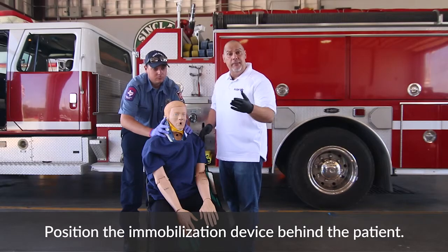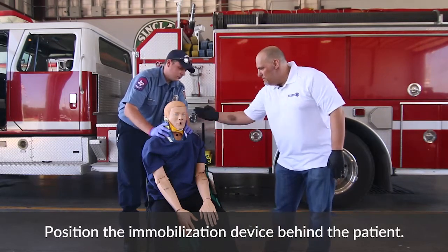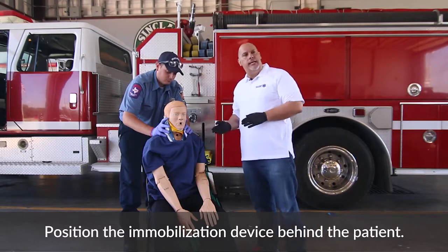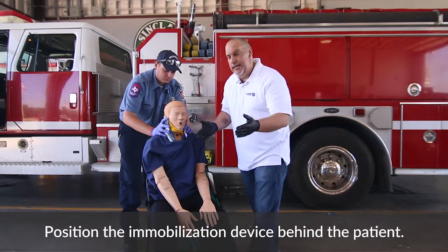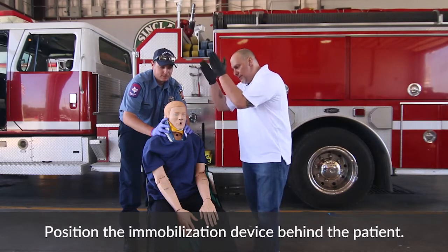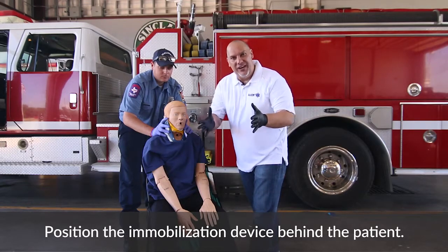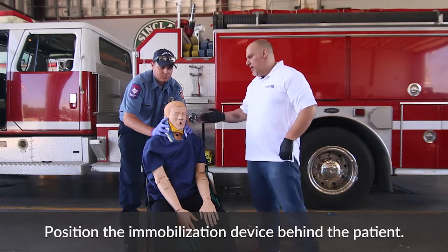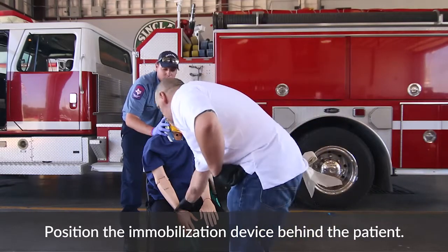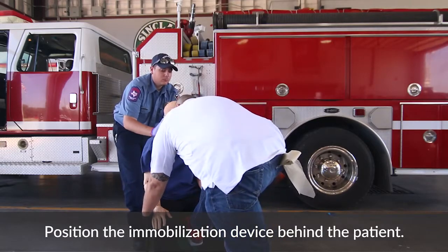Next, we want to go ahead and place the device behind the patient. Look at what we're doing here — we're holding good manual inline stabilization. The patient has his back against the backrest of the chair or whatever they're sitting in. How do we get them forward now without disrupting that manual inline process? We're going to use inertia to help. As my partner holds manual stabilization, I'm going to put my foot on the chair.